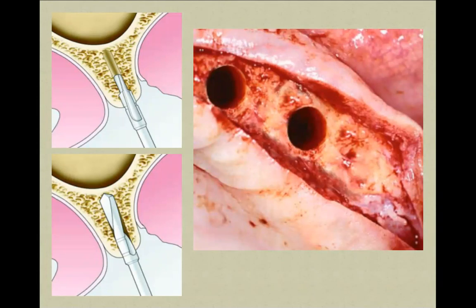In MIS it will be 2.0, no 2.2, 2.9, 3.3, 3.75, 4.2, and then 5.0. So as you can see, that's somehow different between systems.